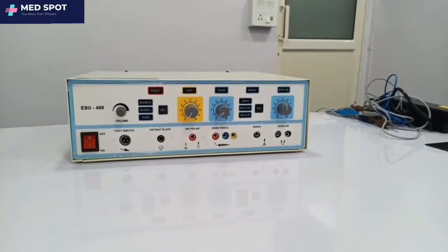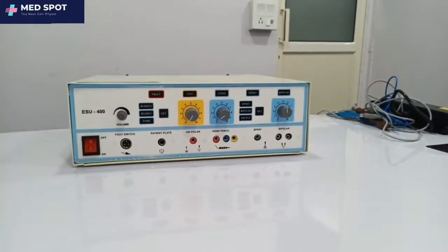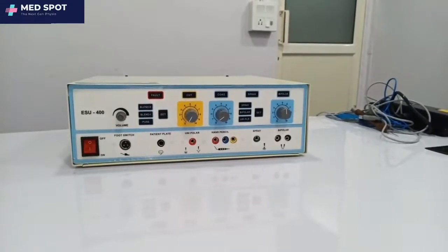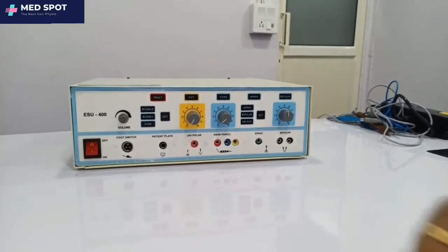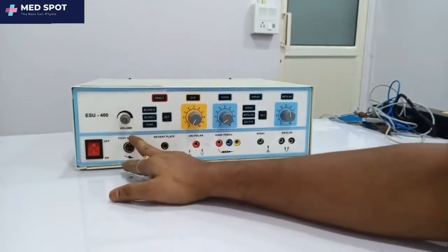Hello everyone, welcome to TechnoCare Medical System. Today we are showing you how to operate the ESU 400, a surgical cautery.